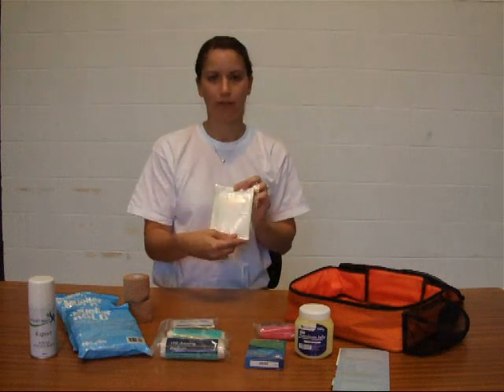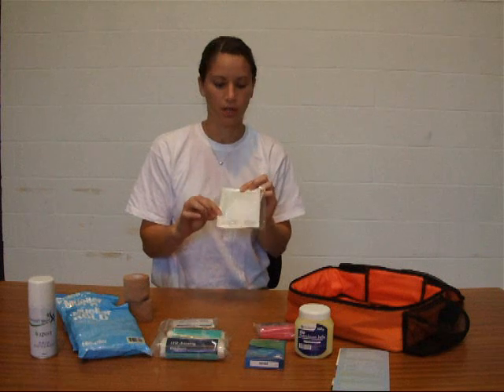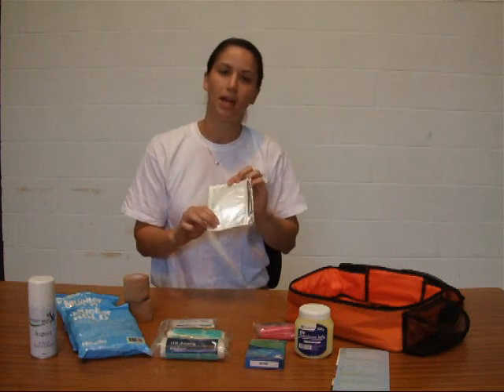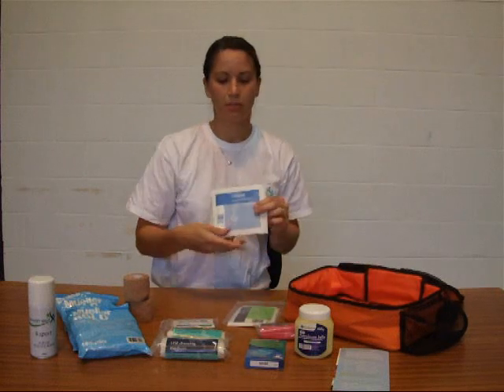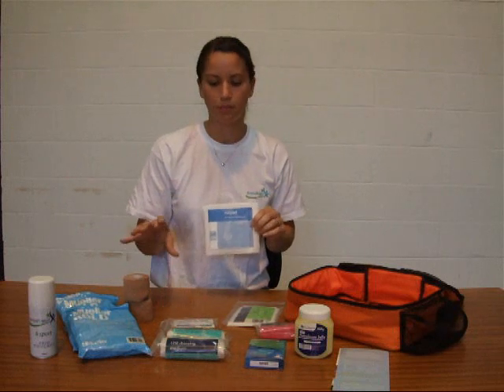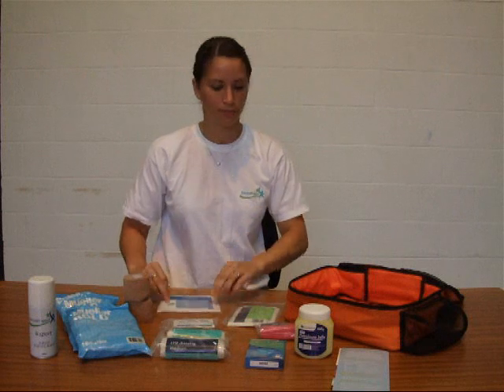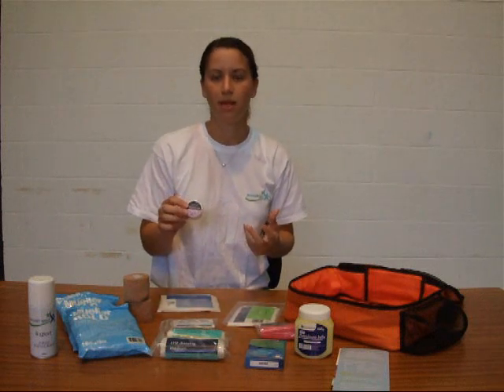We've got some big plasters — absolutely fantastic, very large lint in the middle, they stick to anything, elbows and knees included. Great to just stick on somebody and get them straight back onto the pitch. We've got some dressing pads similar to the medium dressing but without a bandage attached, so you stick that over a wound and then use some sort of tape to hold it in place — either cohesive bandage or microporous tape, which is a bit like a paper tape.